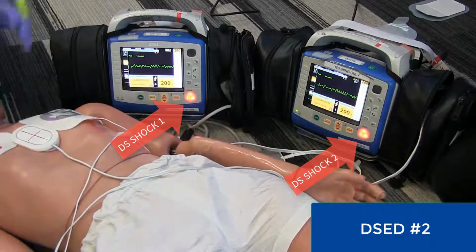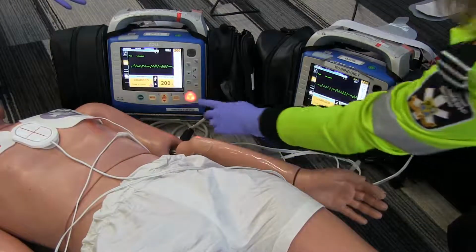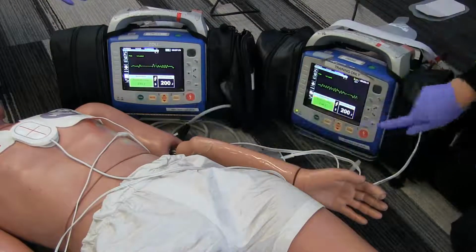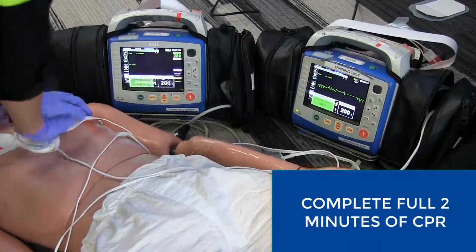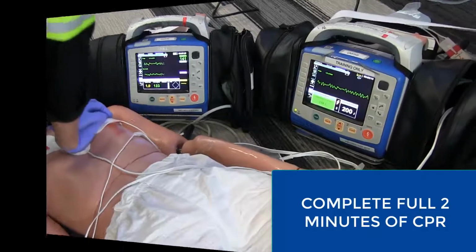Okay, everybody hands off. I'm clear, you're clear, everybody's clear. Shock one, shock two, continue CPR. Complete the full 2-minute CPR cycle.